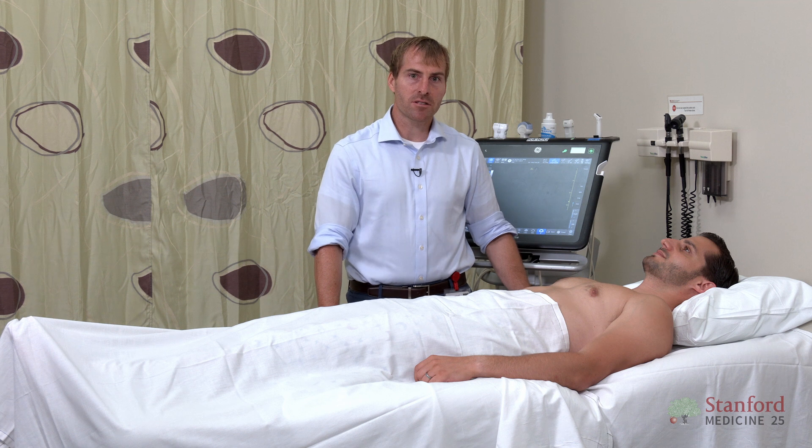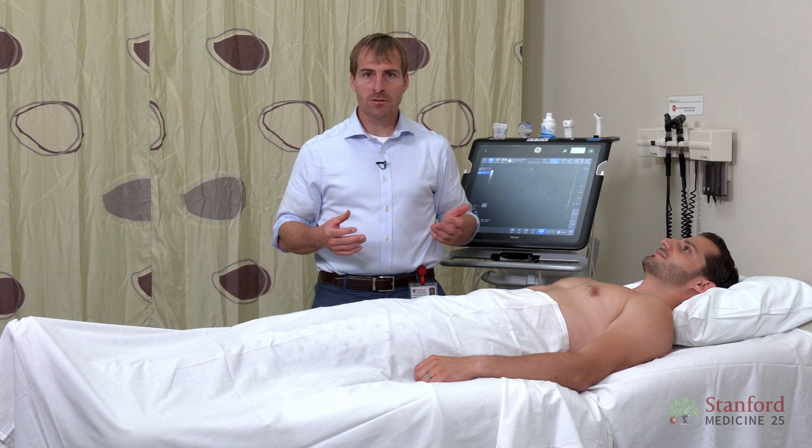Now we're ready to look at the lungs themselves. When we do lung ultrasound, there is not one defined way to do this — it depends on how sick your patient is. If my patient is in extremis, ready to be intubated, I may not need many windows to understand what's wrong. However, if the patient is completely healthy and I'm looking for very subtle signs of pneumonia, I may need a much more thorough scan. There are many different protocols in terms of the number of windows you get, and it will depend on your clinical setting and how sick your patient is to determine how many parts of the lung you need to examine to feel confident making a diagnosis.